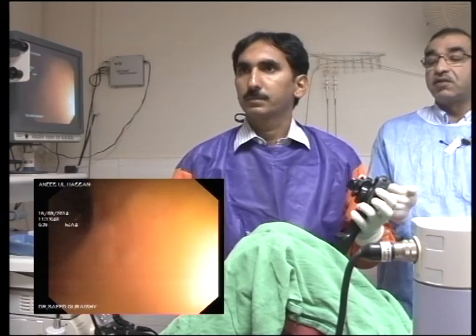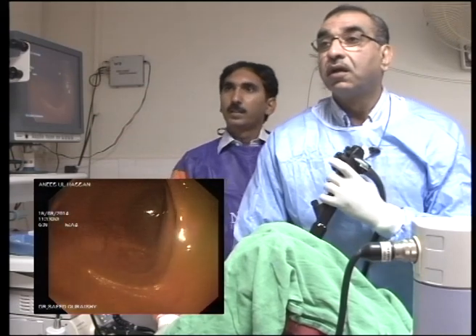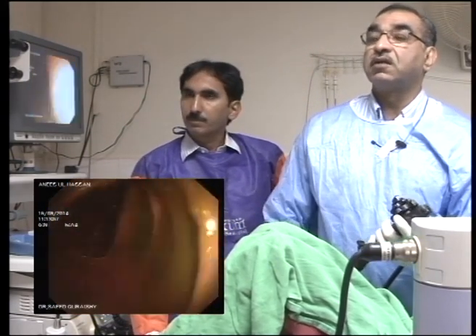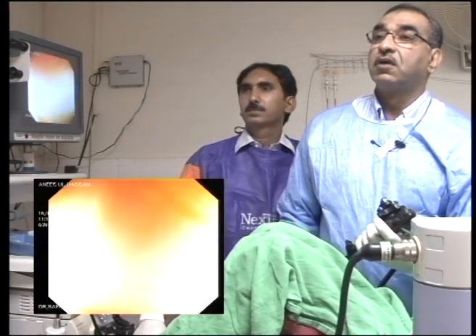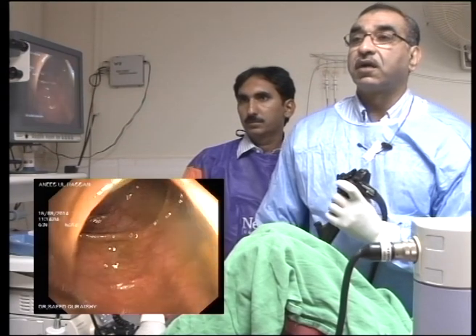Okay, I'll just show you. Okay, just let me go there. Okay, so right now there is a lot of looping here. So what I'll do is I'll just try and take that out for you, and now let me try and get you back in there.